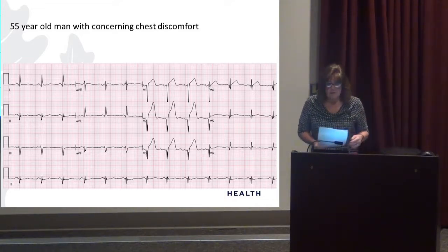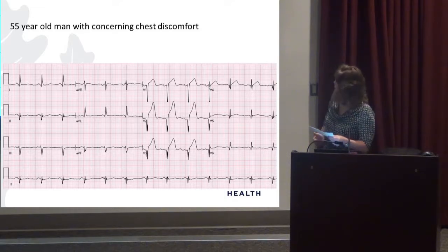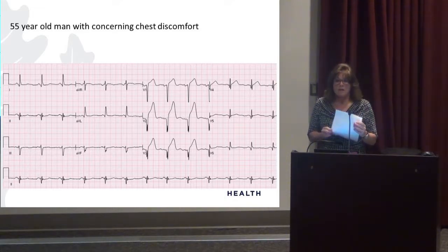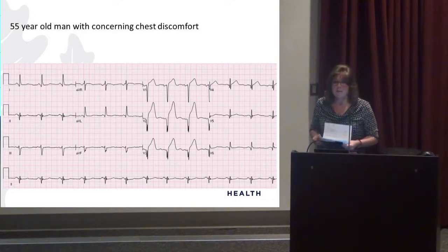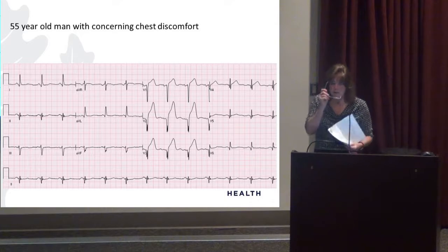Does he have ST elevation? Where? Okay, everybody see that? Because we really can't go on unless everybody sees that. This is a straightforward ST elevation, in the leads, like you said, and that's the anterior septal region. We say this patient's having a big anterior septal MI. Is everybody with me on that, or else we can't go to some harder ones? Everybody can read a basic STEMI. Okay, onward.